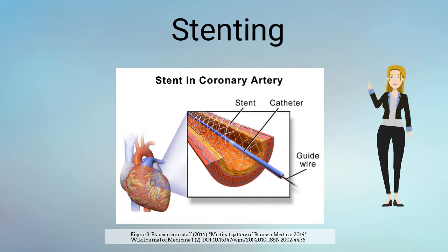During your cardiac catheterization, your doctor may find a narrow or blocked artery in your heart that requires stenting. This is done to open the artery and restore adequate blood flow to the heart.